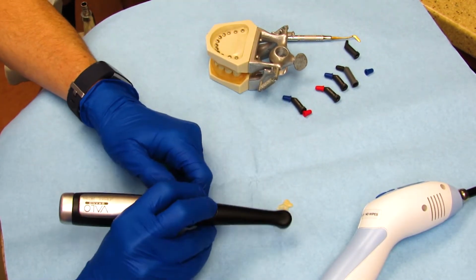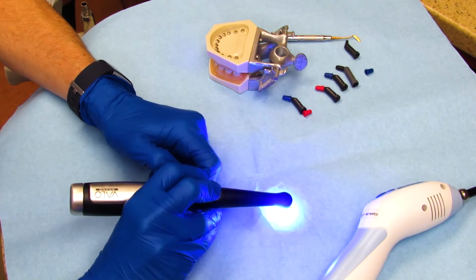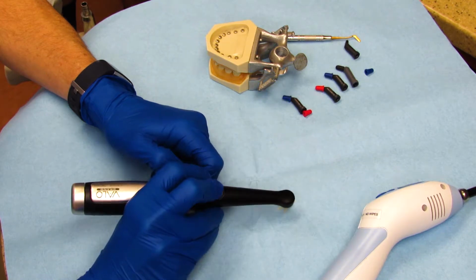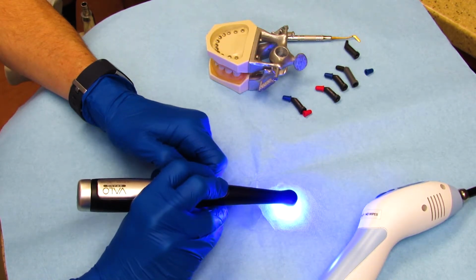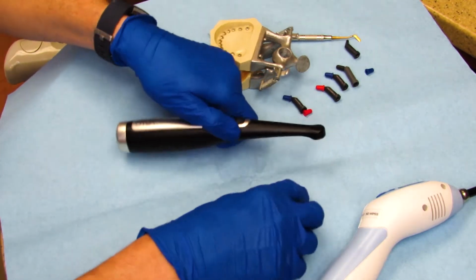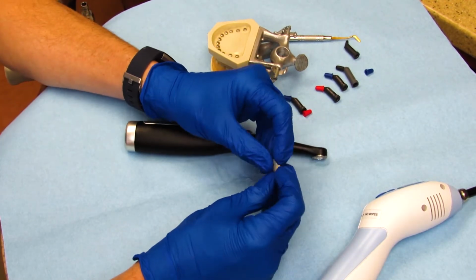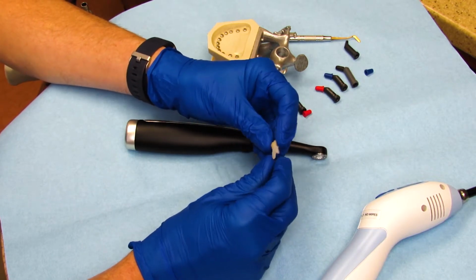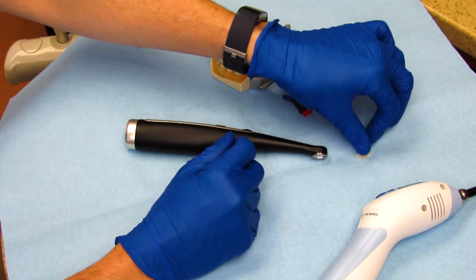What we do now, I'm going to shine this curing light on here. And as I'm curing this, the blue light goes and makes the filling material become hard. So now when I pick this up, it's hard and it does not move, and it fits very easily. So that's what we use them for.